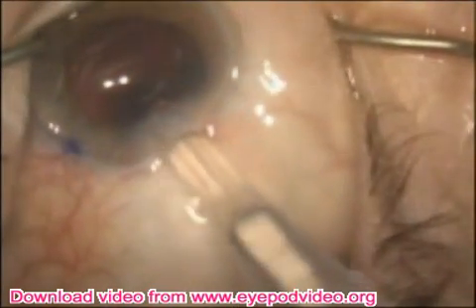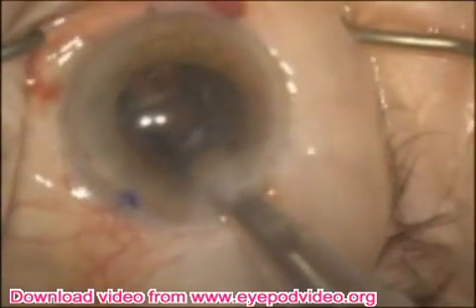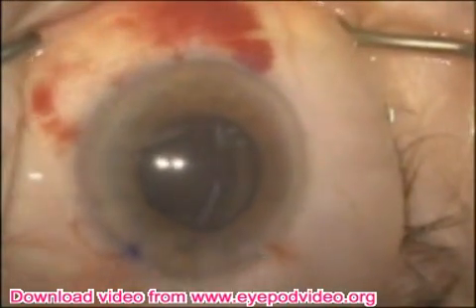A slight twist and the capsular tension ring eyelet is released. Here a model SA60 lens is placed into the capsular bag.